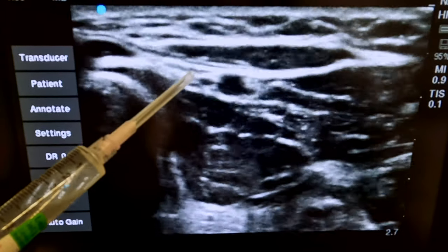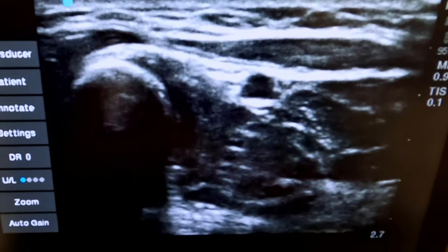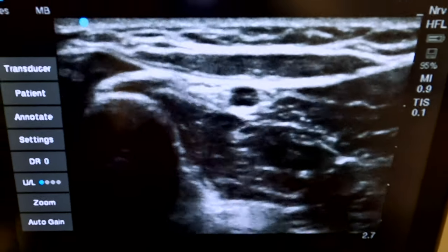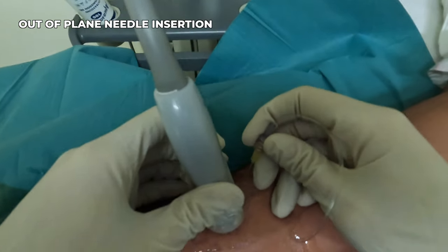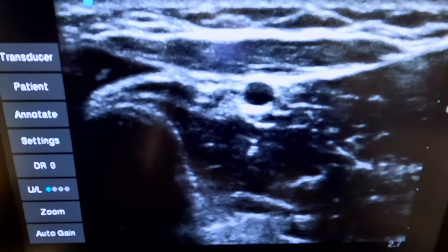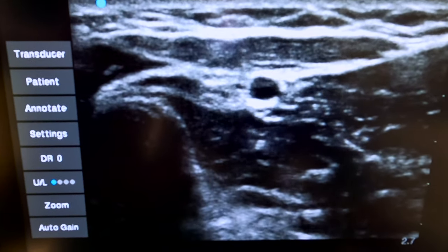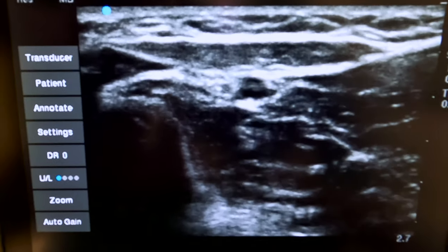This is a pretty good place to block it. We can do in-plane or out-of-plane — I think out-of-plane will probably be the easier option here. The needle is now right next to the radial artery, and now it's positioned in the space between the artery and the nerve.